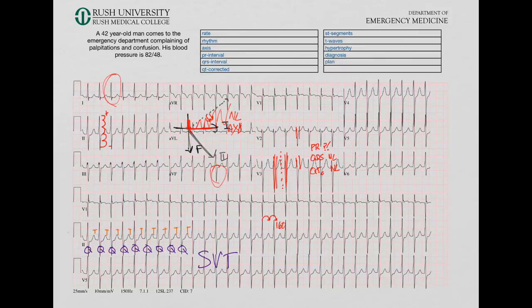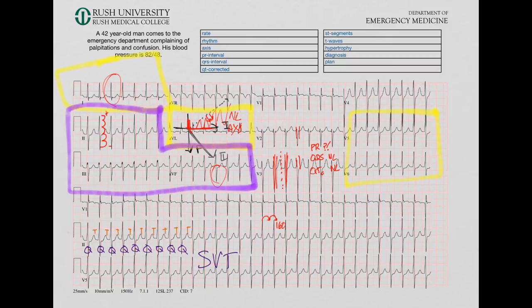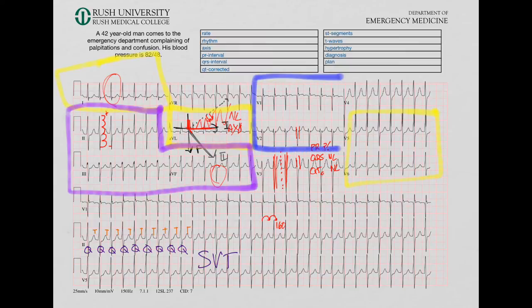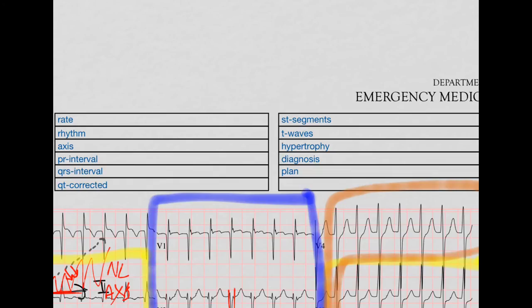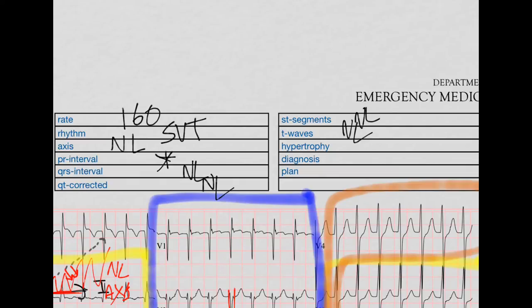Next, let's do our ST segments and T waves. High lateral leads: T waves are upright, ST segments are flat — those look fine. Lateral leads: same thing, fine. Inferior leads: T waves are upright, ST segments about flat — those look fine. Septal leads: T waves look flat; V1 may be inverted, but V2 looks fine. Anterior leads: the T waves are a little big but fine. So our rate was about 160, rhythm was SVT, axis normal, PR we couldn't do, QRS normal, QTc normal, ST segments normal. Our diagnosis is SVT.